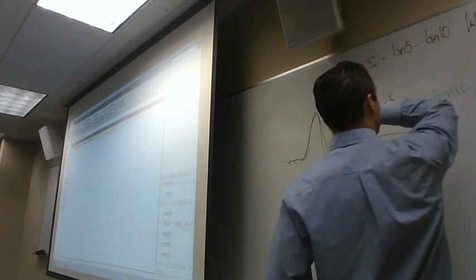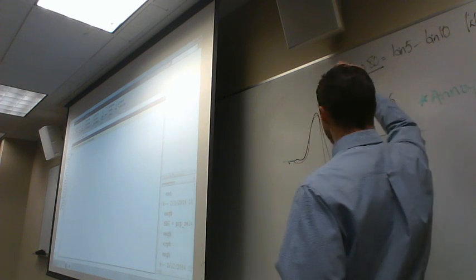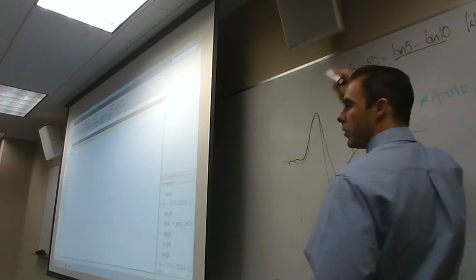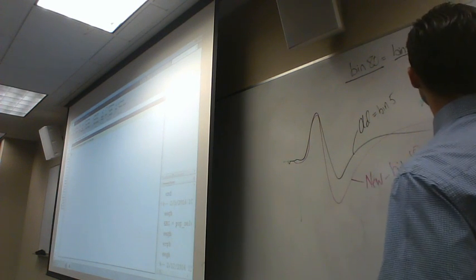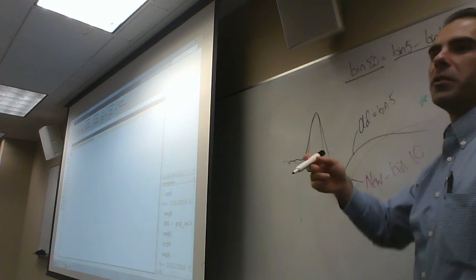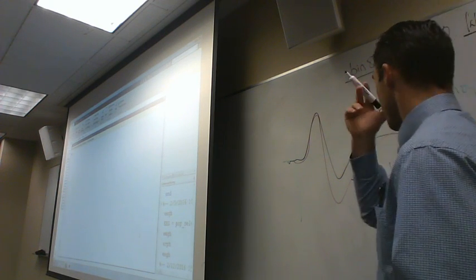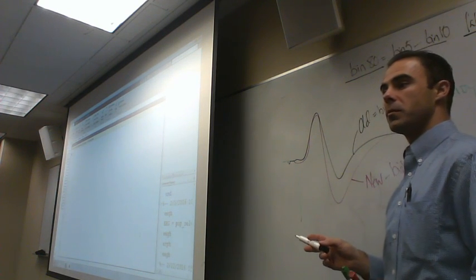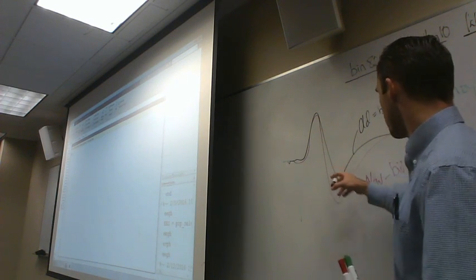Okay, so we have 4 parts to this. We have defining what our new bin is. We have defining what calculation is being performed. We have this marker that tells us what we're going to call it, and this is the answer to what we're going to call it. Now, what's a difference wave? Yeah, you're subtracting this from this.